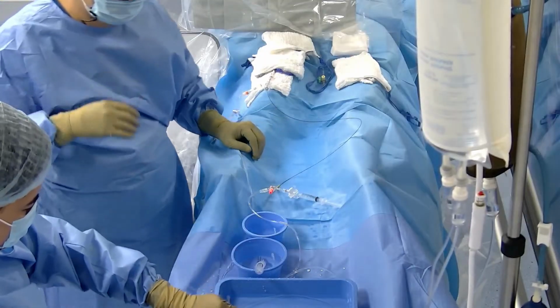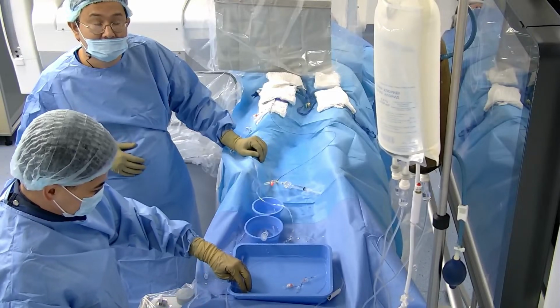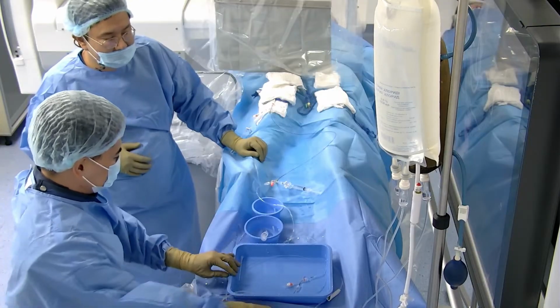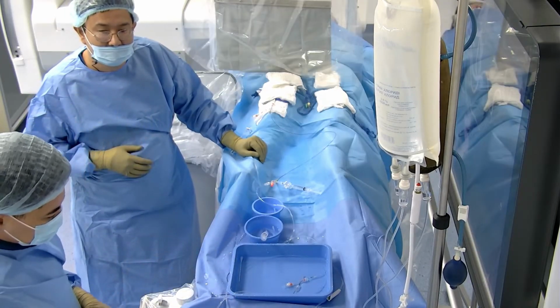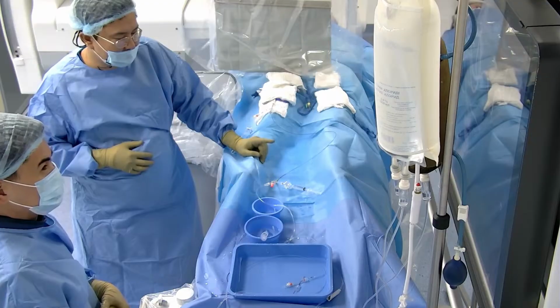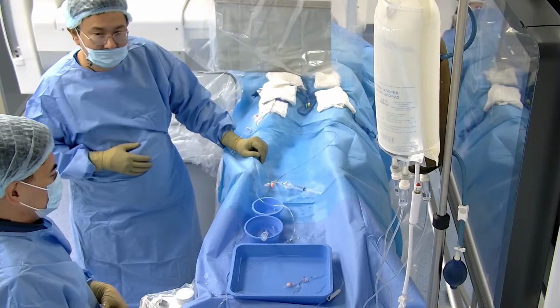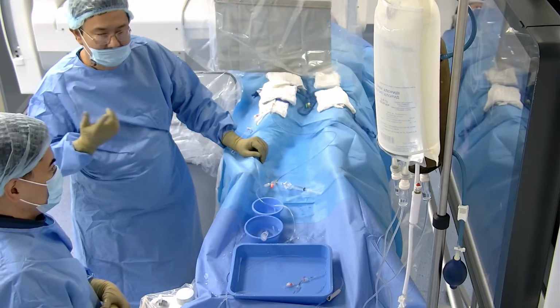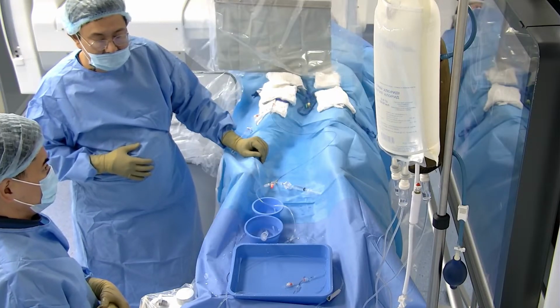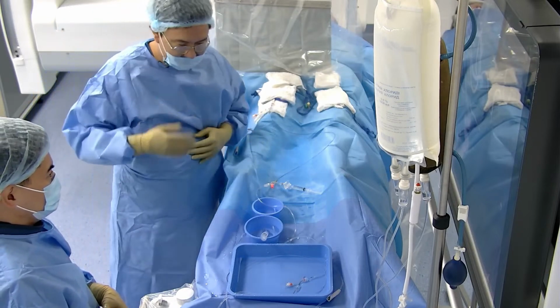And just after the link in Paris, we had a conversation with Jivan Ishlak. He's from Istanbul, and he also mentions that the next WLNC should focus on some cases of how to properly prepare the balloon. And nowadays more and more people start to use double lumen balloons for AV fistula, AVM treatment, and for any other reason. And I think those complications might happen in every place.